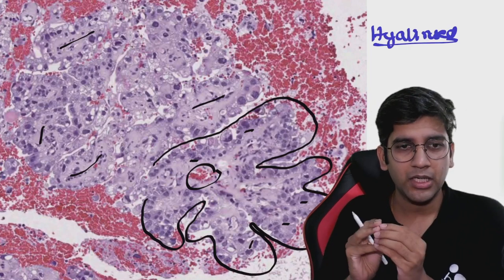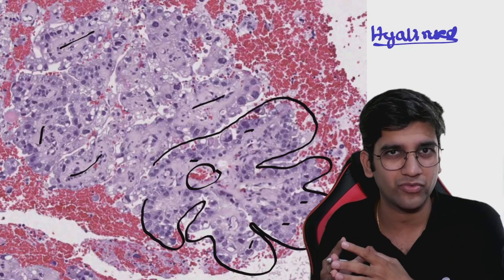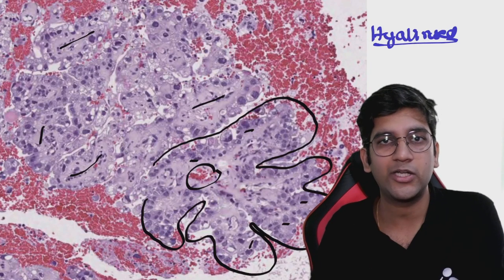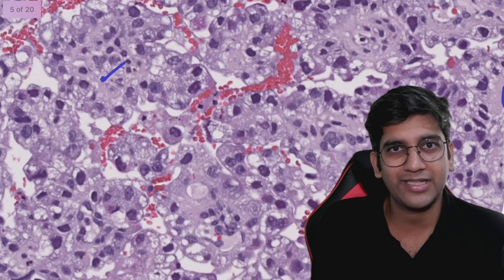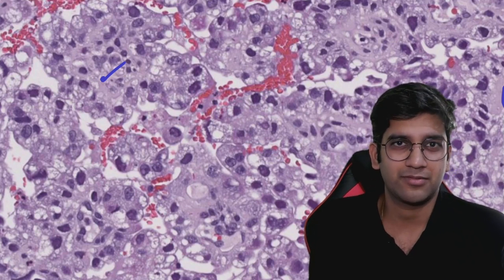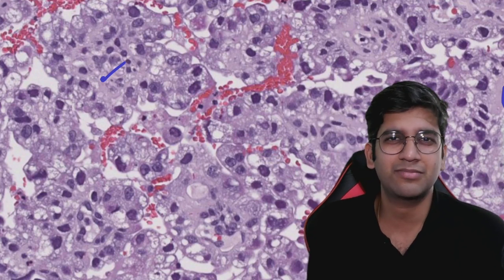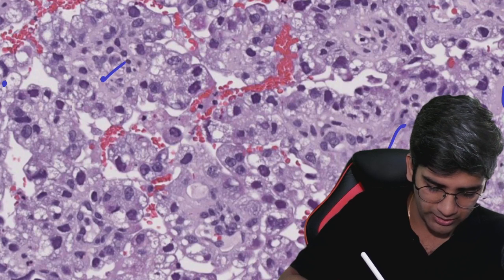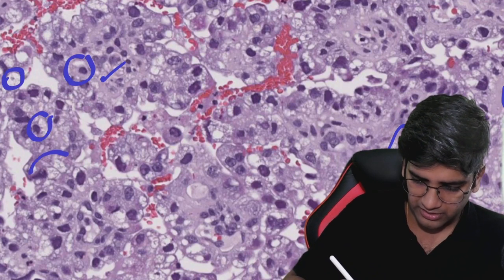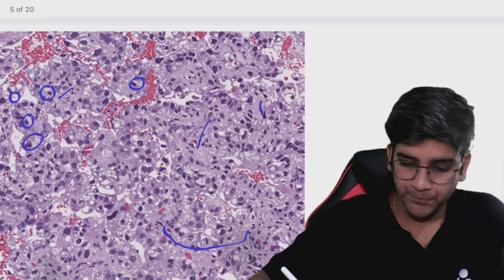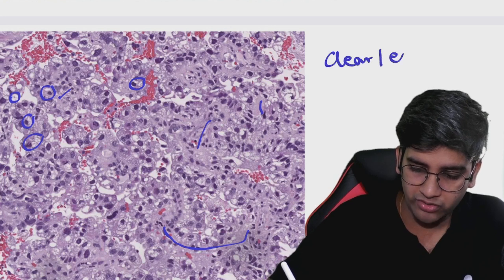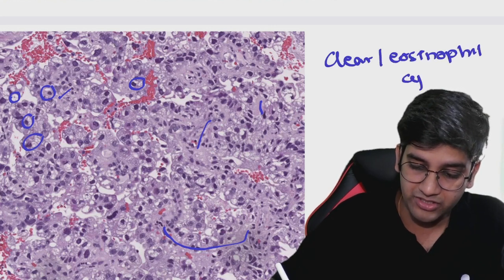Now I have to go into the cellular architecture and cytological features. We already concluded the nuclei are approximately grade 2. Zooming in again — looking at the cytoplasm, one obvious feature is the pink eosinophilic cytoplasm, which serous carcinoma also has. But in addition to that, in many places you have clear areas. So there are two types of cytoplasm here: lots of eosinophilic cytoplasm and also lots and lots of clear areas. Even at low power you can see lots of clear areas. So clear and eosinophilic cytoplasm is again a characteristic finding of the tumor I'm going to discuss.